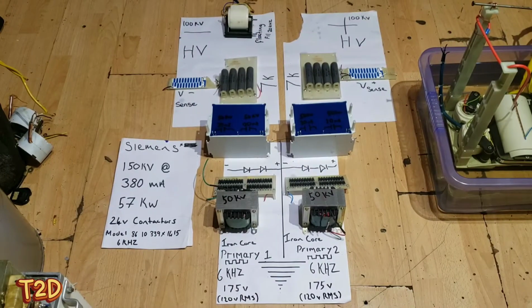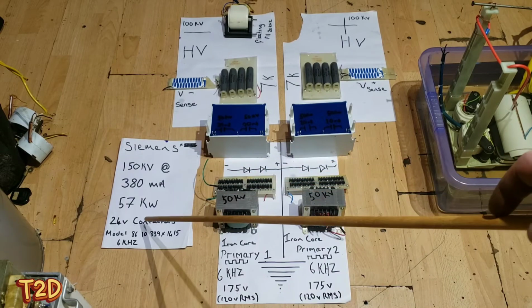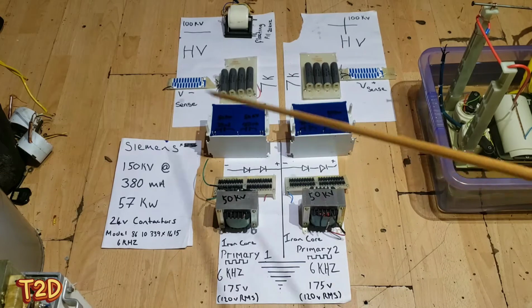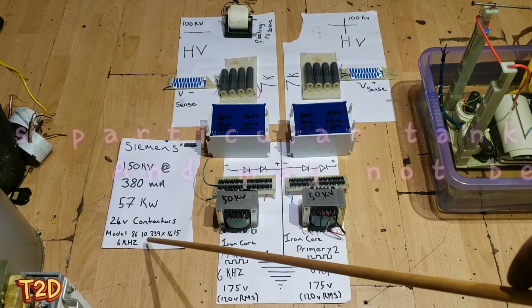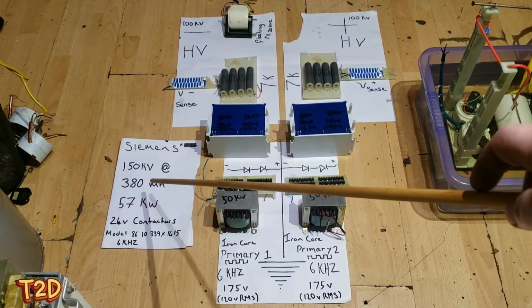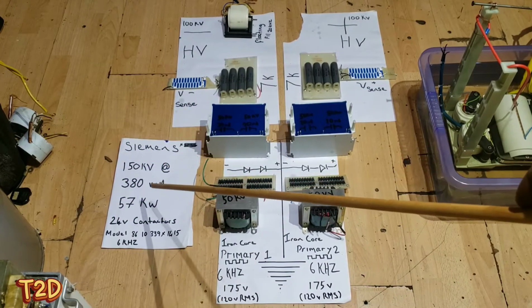Right guys, so I've laid out here in block form basically what's inside the X-ray generator tanks. As you can see here, these are Siemens tanks. This is the model number of the particular tank in question, the one we're talking about right here, and the operating frequency of these is 6 kHz. It's 380 milliamps at 150 kV, and that is 57 kilowatts.